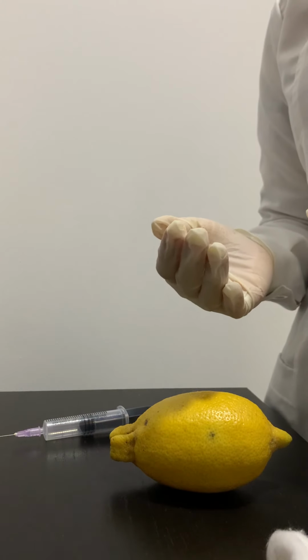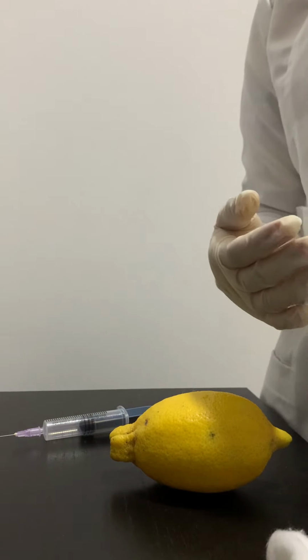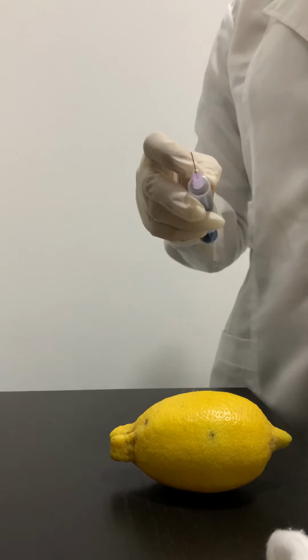In this case, the needle might break if there is excessive force around the muscle. So, the needle is advanced at 90 degrees.